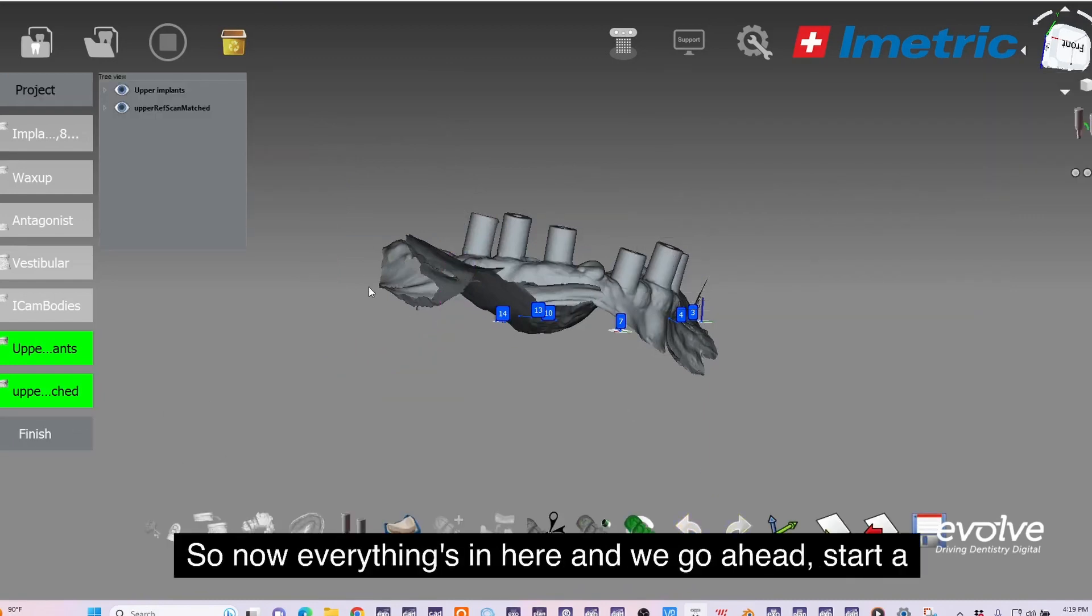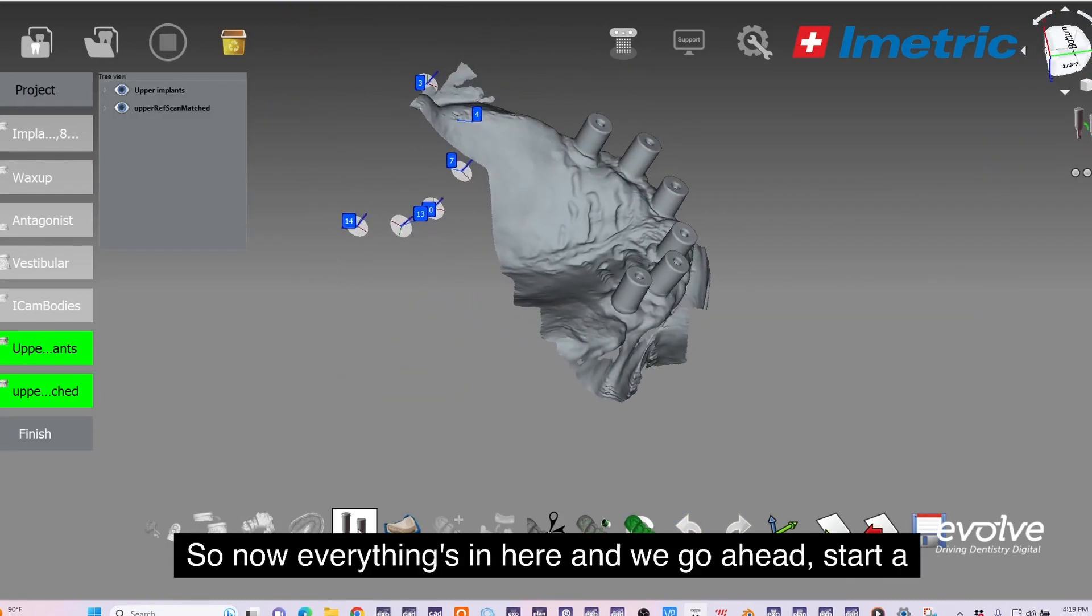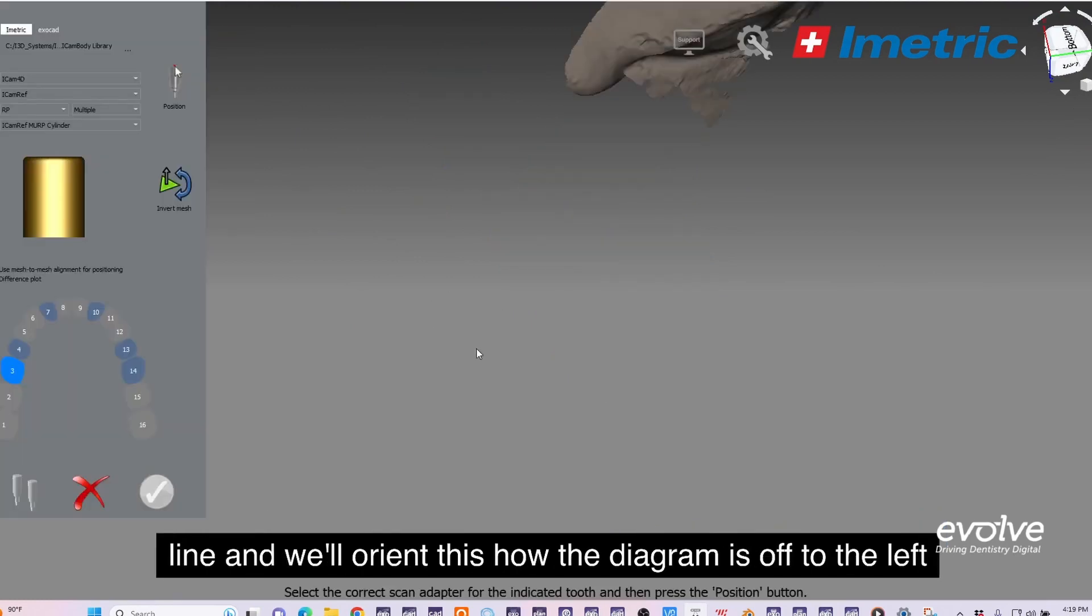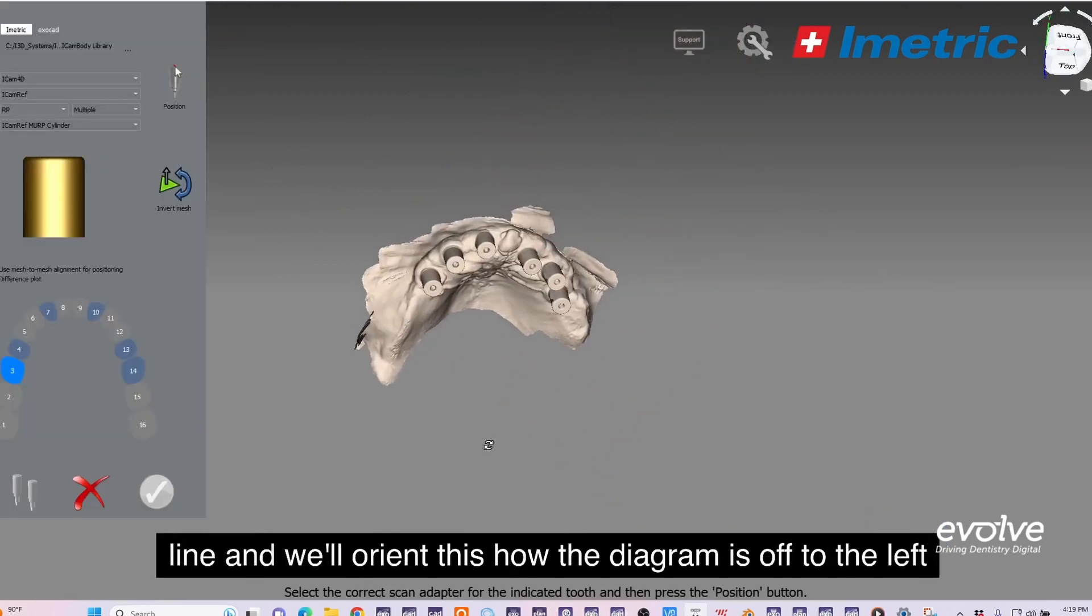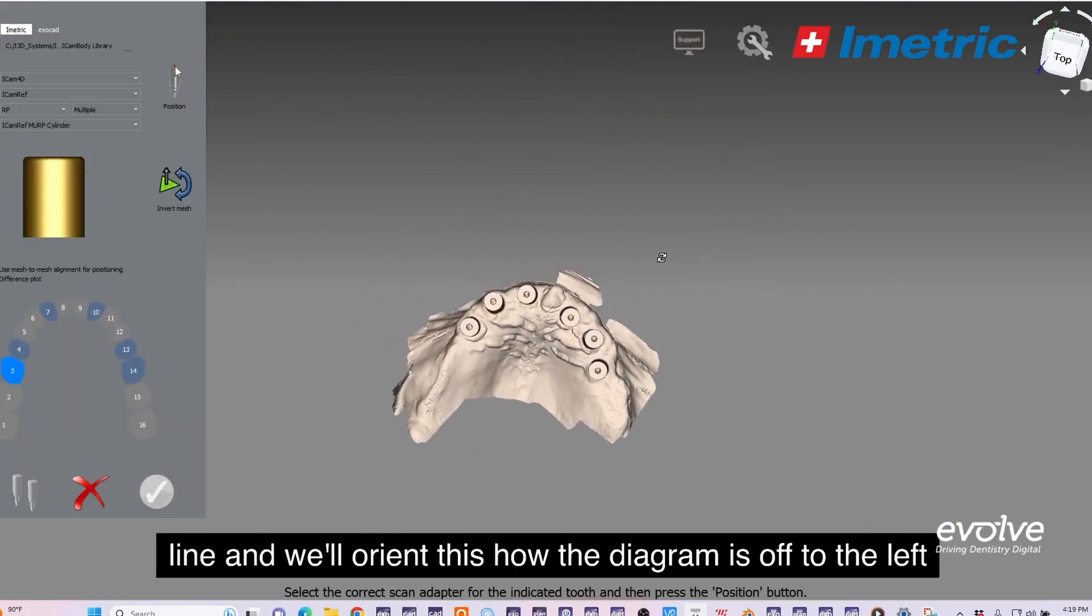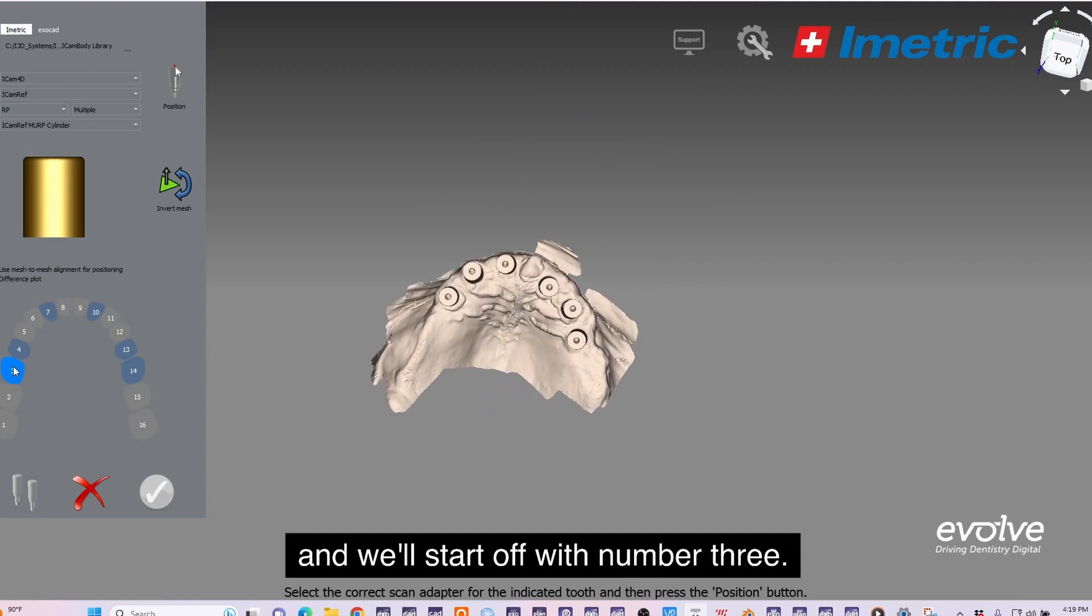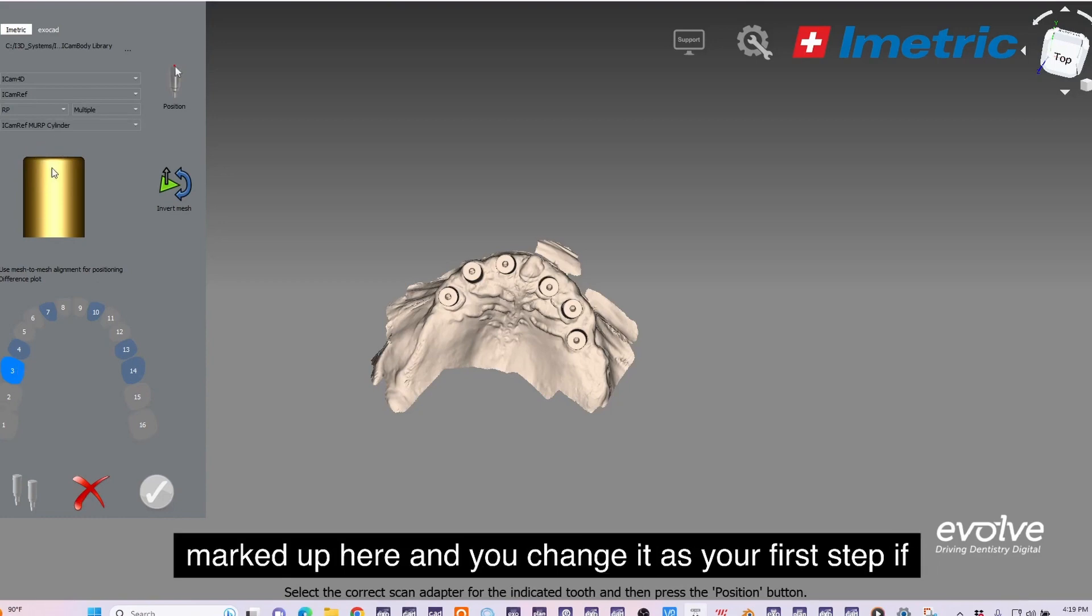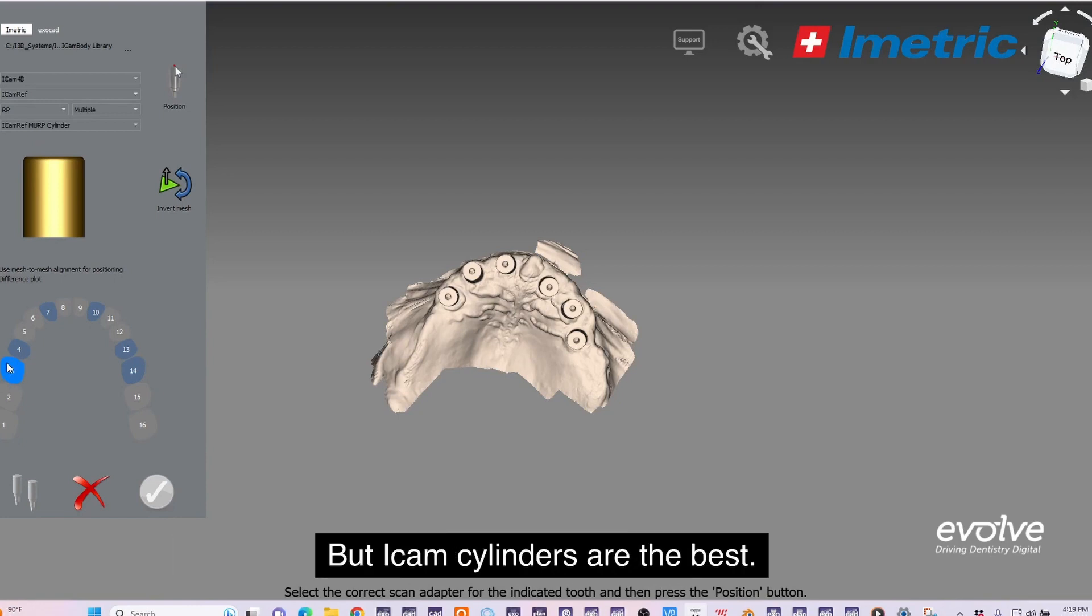Now everything's in here. Start alignment and we'll orient this how the diagram is off to the left. We'll start off with number three and we just need to make sure the proper scan body is marked up here. You change it as your first step if you need to, but iCam cylinders are the best.